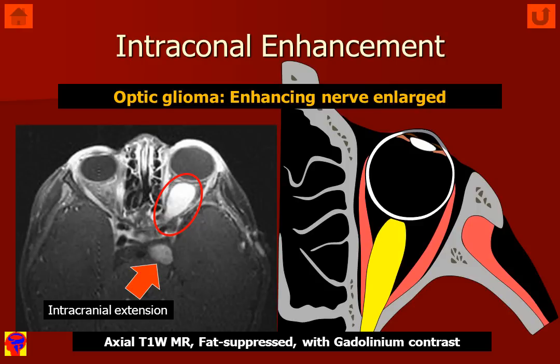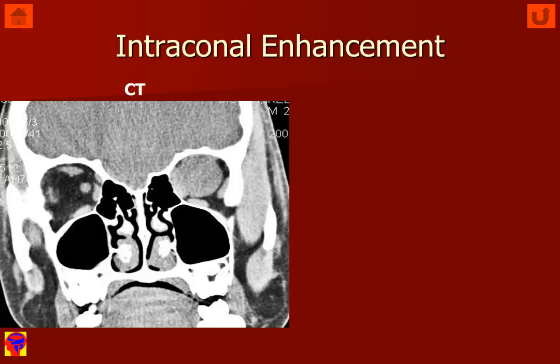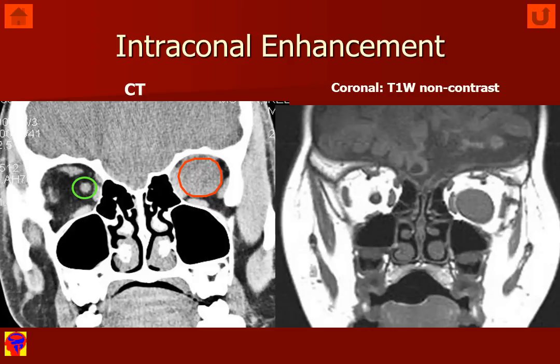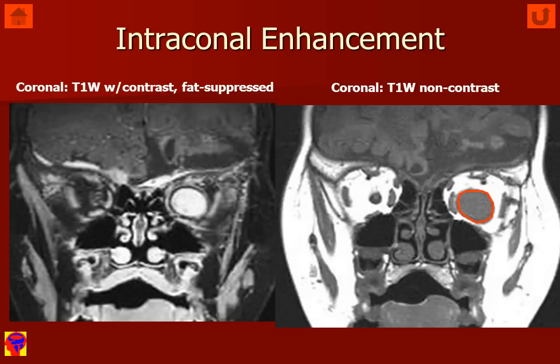This is a different patient with the same disease process. We can see the normal optic nerve diameter in the patient's right orbit, and in the patient's left orbit we see an intraconal mass. The MR scan in the coronal plane without fat suppression shows us a normal diameter optic nerve on one side and the optic nerve mass on the other. After giving contrast enhancement and using a fat-suppressed T1-weighted technique, we can see the enhancing intraconal mass lesion, and the normal diameter optic nerve on the opposite side does not show contrast enhancement.